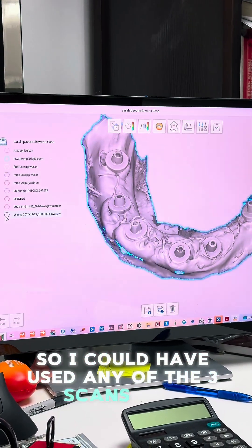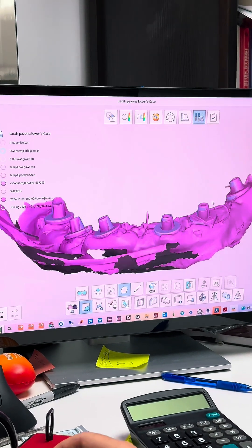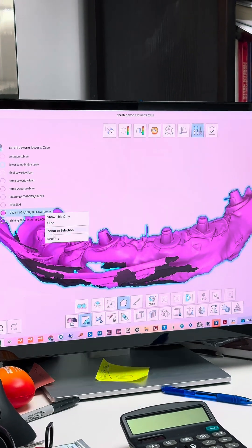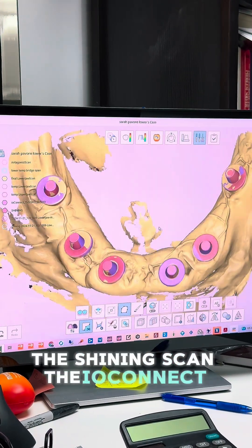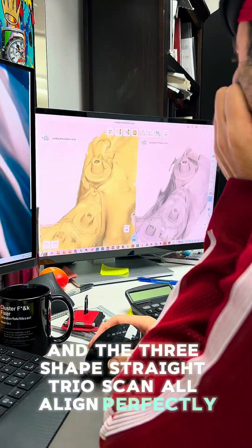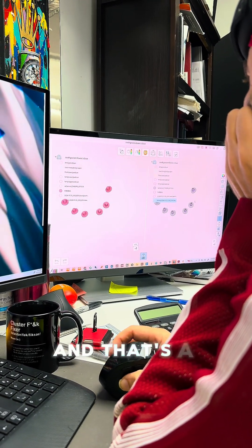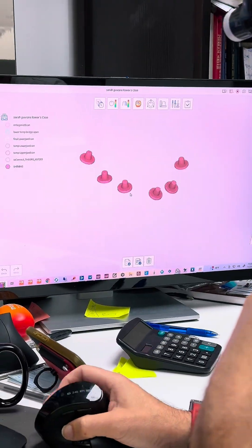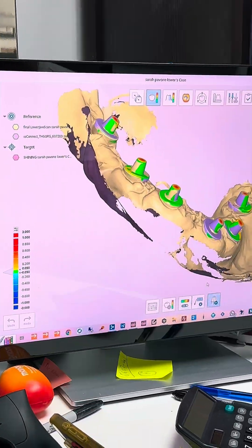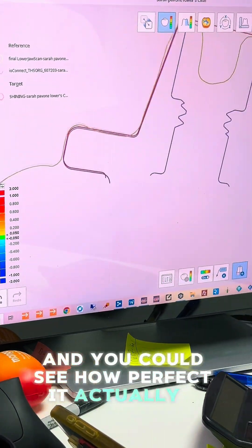I could have used any of the three scans. If you look closely, all three scans - the Shining scan, the IO Connect scan, and the Three Shape Trios scan - are all aligned perfectly, which is very interesting because all the data was great. That's a telltale sign of what everything will look like. You can see by all those green overlays - with Shining in purple - how everything is perfectly aligned and clear, within 10 microns of each other.